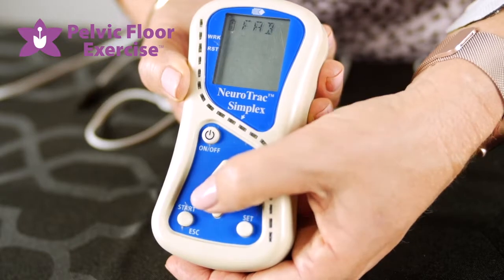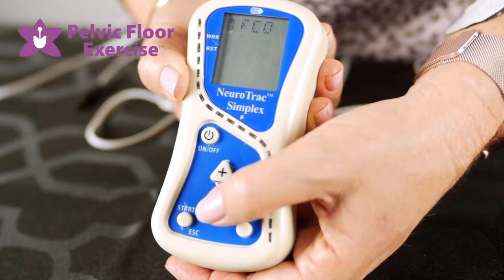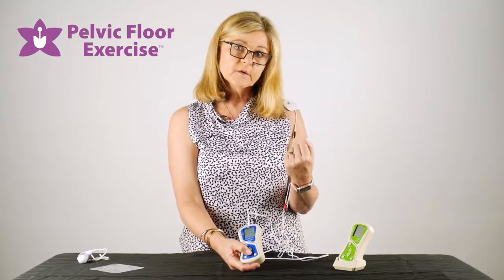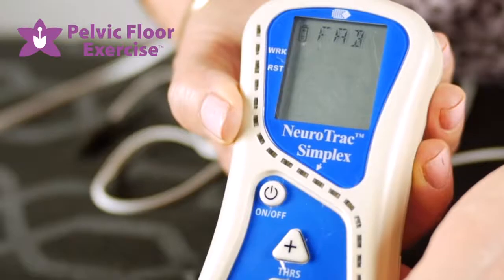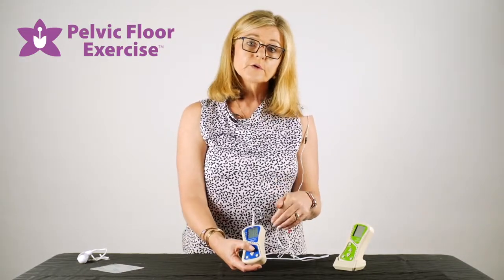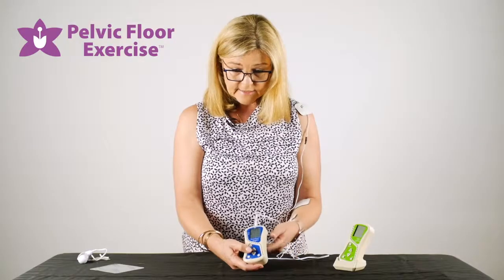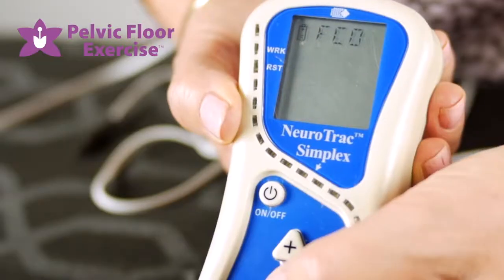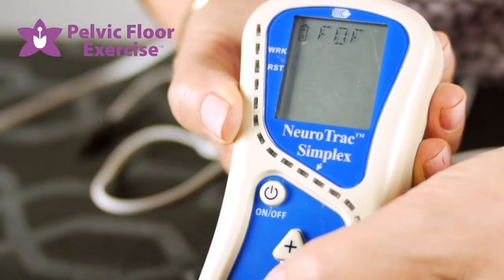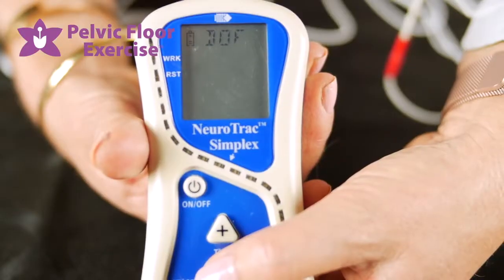Pressing SET again, you'll see FAB, FBL, and FCO. FAB means above the threshold — if you want the patient to get above the threshold before the biofeedback kicks in with the lights or sound, choose that one. FBL is below the threshold, used when you're looking at relaxation. FCO is for both above and below. You can also choose FOF to have sound off, so you won't have any sound signals.